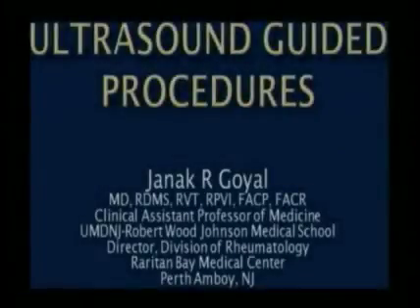Okay, what I'm going to talk about today are some of the techniques which I use to guide injections under ultrasound guidance.